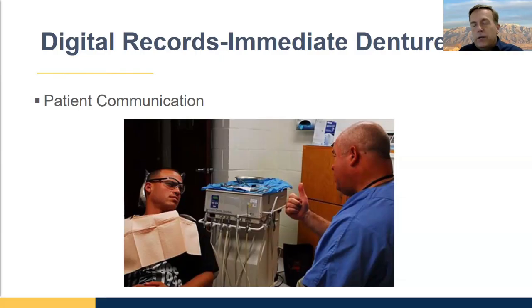You all know that when you extract the teeth, the resorption is going to be much greater than that. So a lot of immediate dentures have short, ugly looking teeth. If we make a second denture from that, then we can take advantage of the resorption. It's unfortunate, but since it's there, we can put prettier teeth in a more ideal position. So I would recommend the 2-denture approach when you're thinking about that.